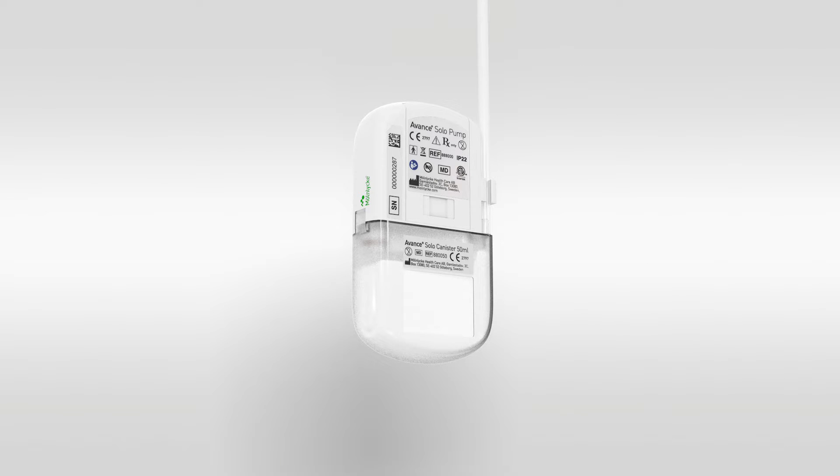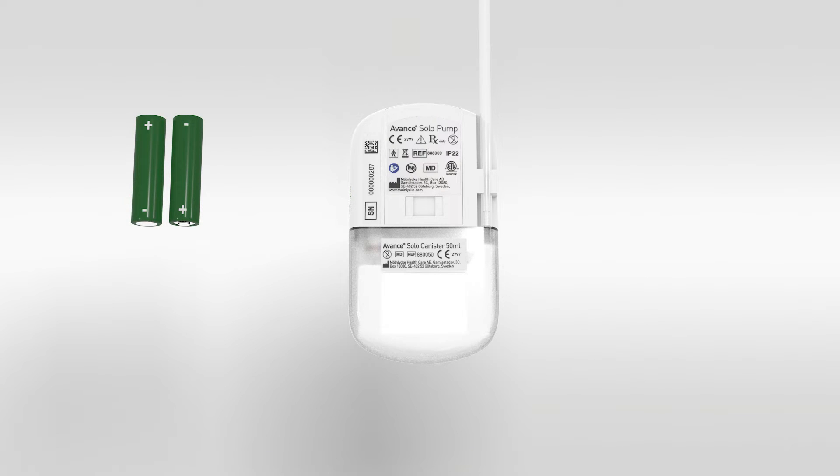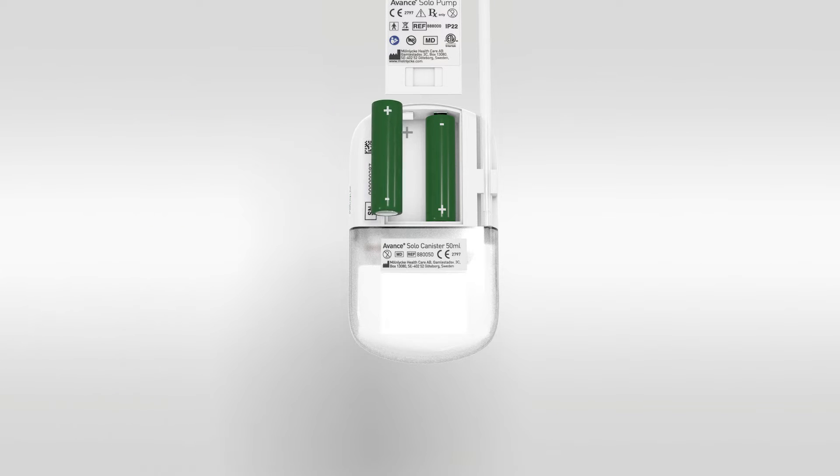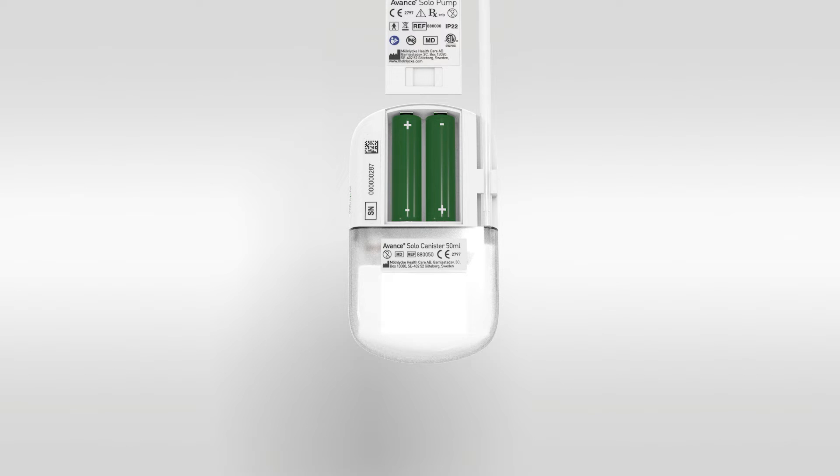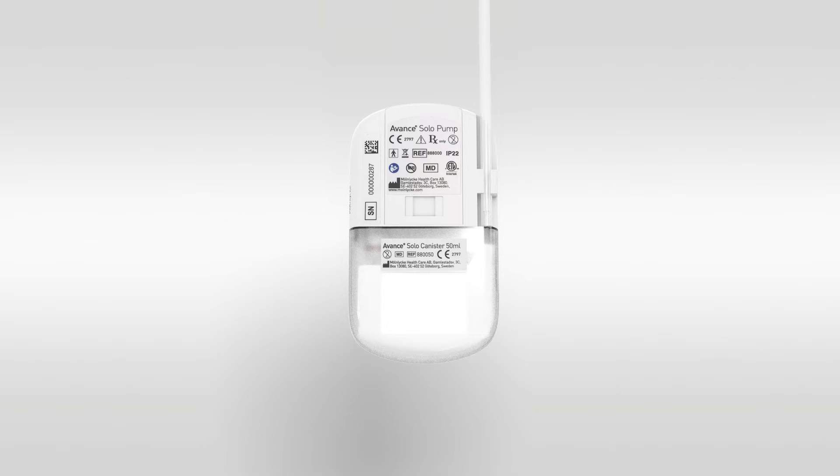Next, turn the pump over and remove the battery compartment door by sliding up. Insert two of the AA batteries supplied with the system, paying attention to the correct orientation of the battery terminals. Now, replace the battery compartment door. When the batteries are inserted correctly, the pump performs an automatic self-check.